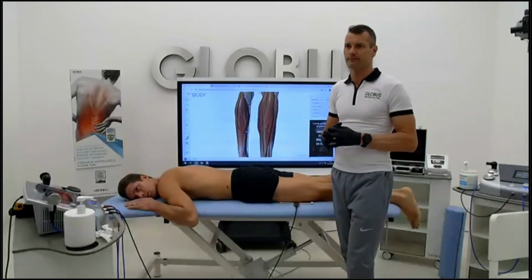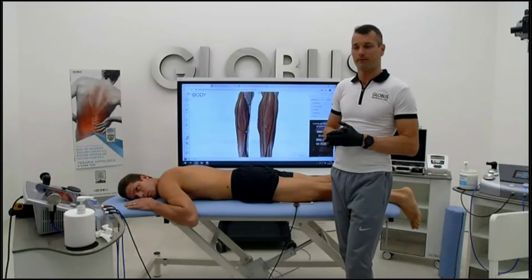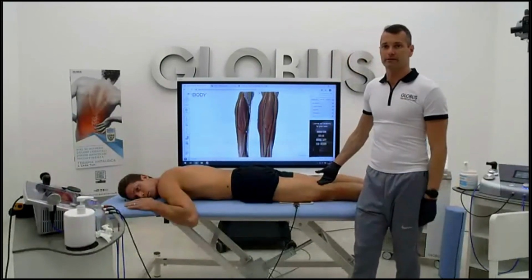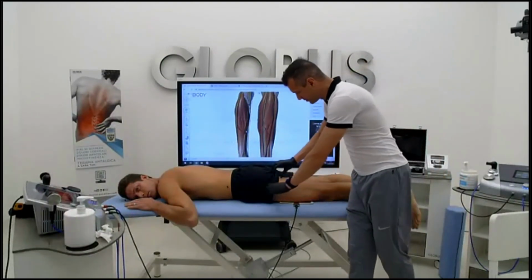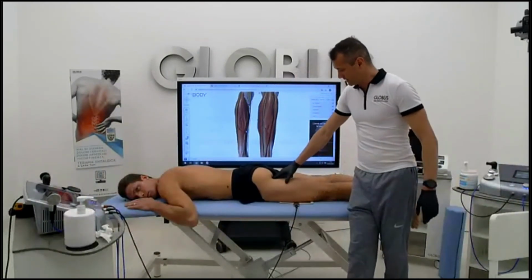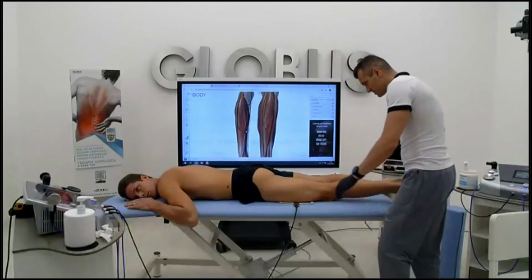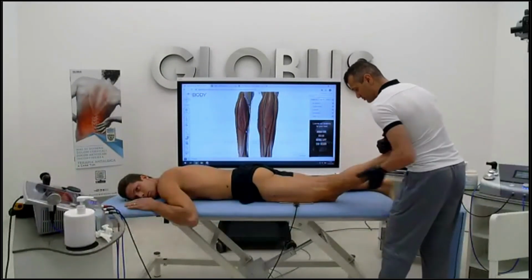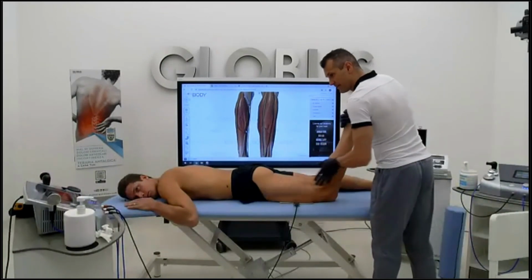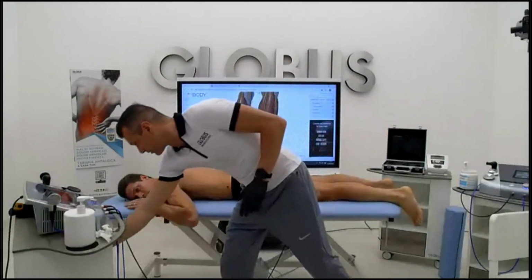So it's a question about the position of the plate for a hamstring pull injury. This could be right. Perfect. This is an opposite geometry. We can easily reach the proximal insertion of the hamstring, and we can easily do some exercise too. Bring the heel toward the gluteus. Okay, just imagine that I'm using the tool, for example.